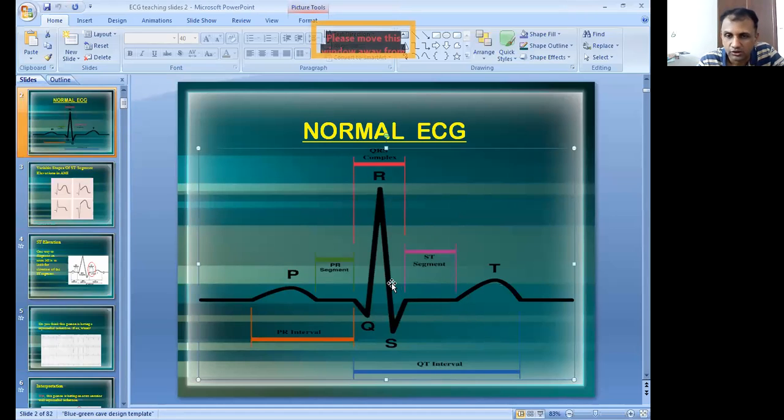So this is the R wave and T wave. Sometimes due to severe tachycardia, this T wave can fall on the R wave, or rather the R wave can fall on the T wave. That will initiate a very severe tachycardia called torsades, and unless you treat it, it can get into cardiac arrest. That can cause broad complex tachycardia.